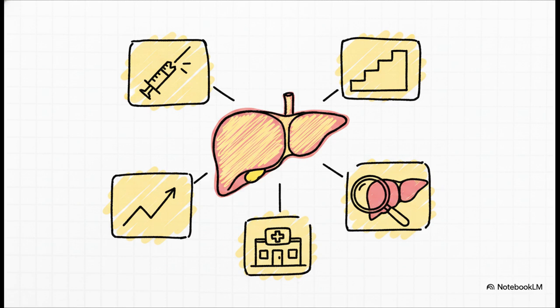Did that diet and exercise regimen actually work? Now you have a hard number to prove it, not just a subjective visual opinion. Furthermore, because it's B-mode guided, you're simultaneously assessing overall liver morphology, checking for tumors or portal hypertension. And best of all, it's highly accessible right at the point of care.